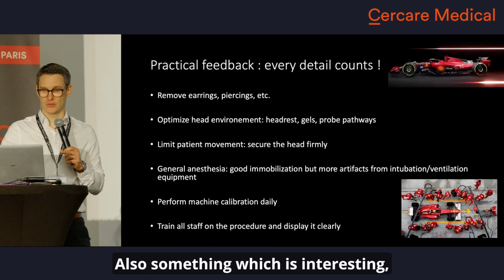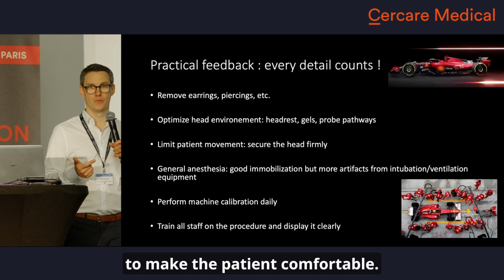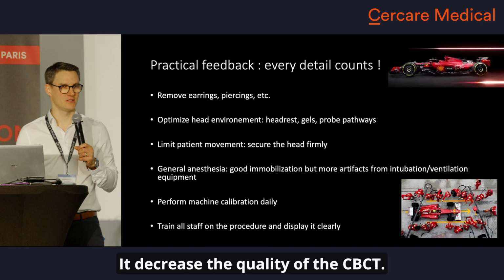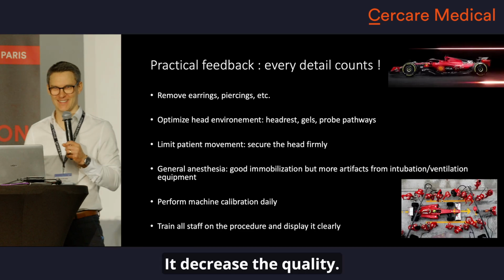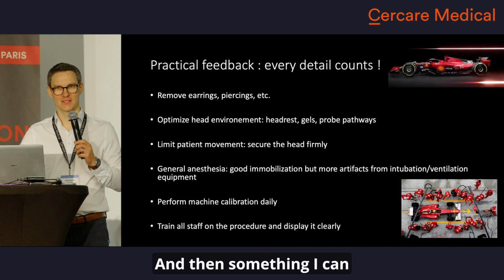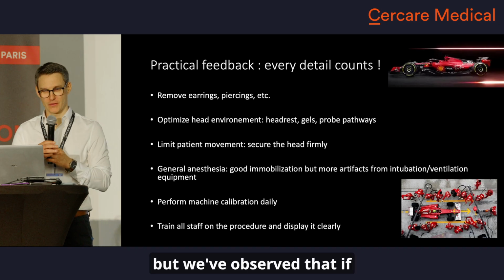Also something which is interesting, the headrest and the gels you put to make the patient comfortable decrease the quality of the CBCT. So don't be so kind with the patient. It decreases the quality.